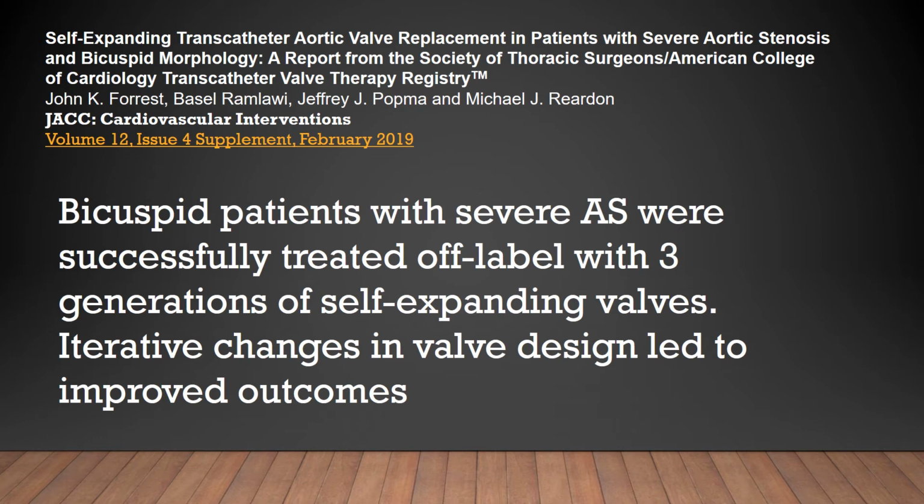What exact difference is there going to be between self-expanding and balloon expandable? Obviously, we need a lot more data. The concern always will be is that self-expanding will have more paravalvular leak. Balloon expandable will probably have a slightly higher incidence of annular rupture, if you will, which is understandable. So again, looking at the anatomy, and we'll go over that very briefly as to how do we think we can decide with the data that's available as to what kind of a valve would potentially benefit more so patients who have bicuspid pathology.